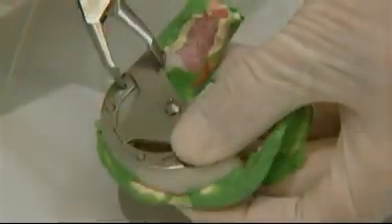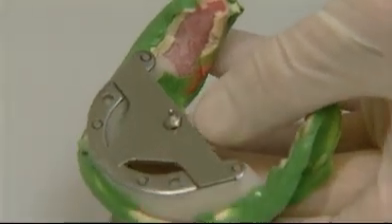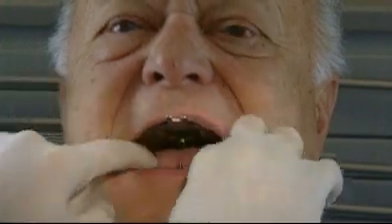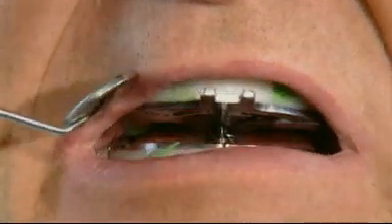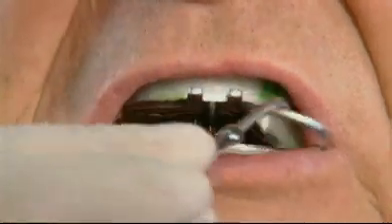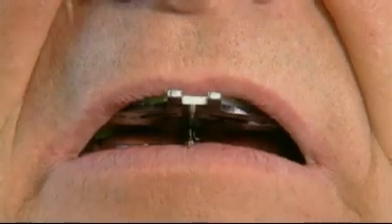The registration plate with the tracing point is placed in the mandible. Check the vertical relation. If necessary, adjust the relation by turning the registration screw. One full turn results in a vertical adjustment of 1 millimeter in the anterior region. After adjusting the height, check the distance between the dorsal ends of the two impression trays. The trays or excess material must not come into contact with each other. The movements of the mandible should not be impaired.